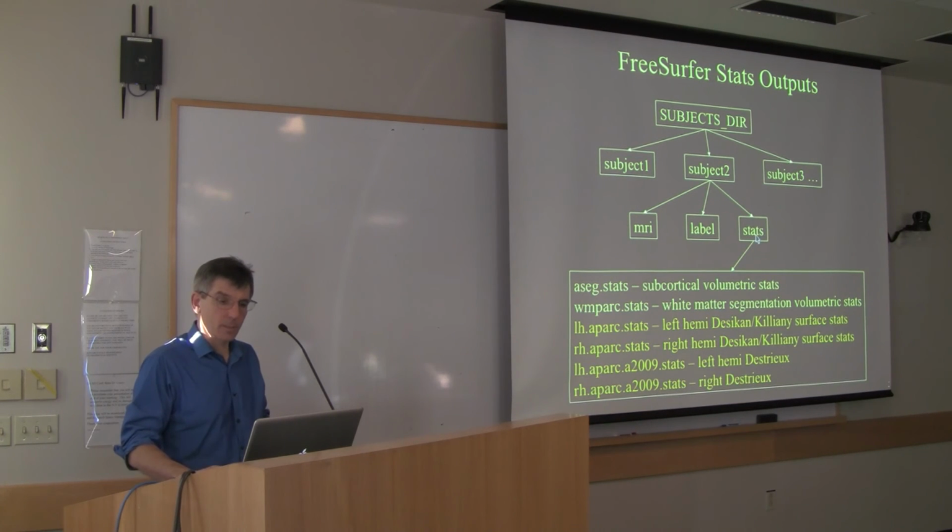So the statistical outputs again are these stat files. There's the aseg and wmparc.stats, and those are volume-based. And then anything with an lh or an rh in front of it is going to be surface-based.